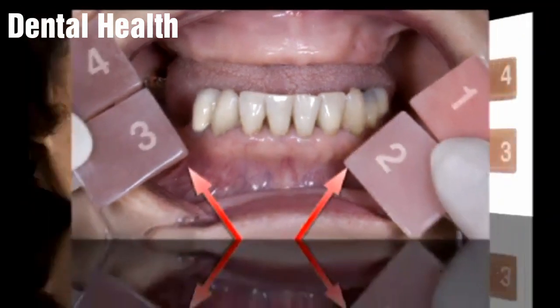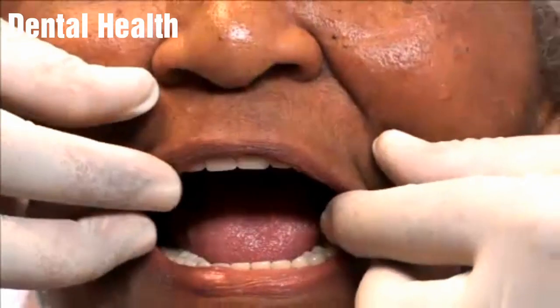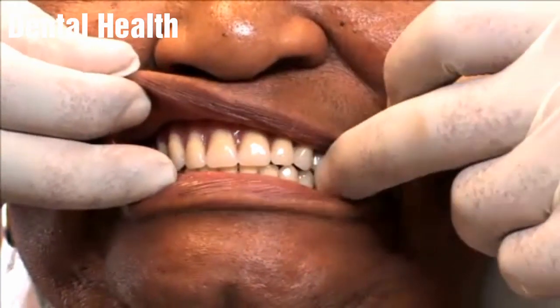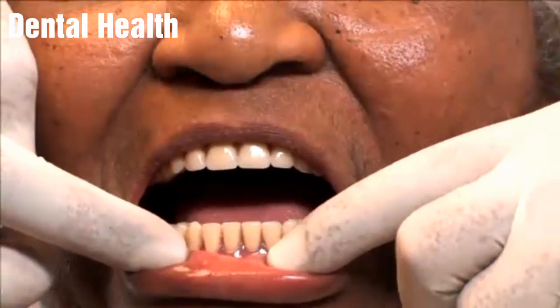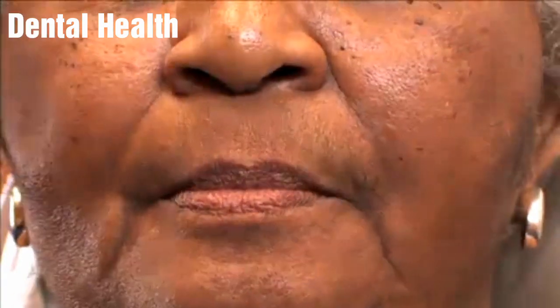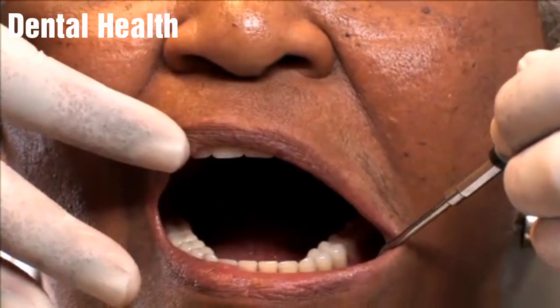Keep in mind, the color of everyone's gums varies. To make a more natural denture, your dentist will help you choose the shade that best matches your mouth. In the subsequent visits, your dentist will adjust your bite, test your speech, and check the appearance and functionality of the denture teeth and gums. After a satisfactory fit and appearance are achieved, the denture is then sent back to the laboratory for fabrication.